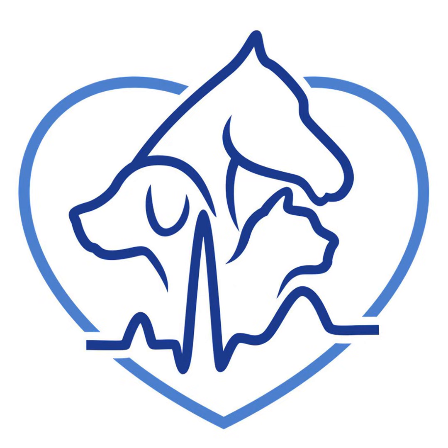So how wide is this area of cats that we should utilize it in? We don't quite know that answer, but we're using it right now. We used it yesterday in a cat who came in for a consultation, who we were measuring a wall thickness on two-dimensional images, both in the short and the long axis, of around 5.8 up to 6.3 millimeters. So this is right on the decision-making borderline. Do you have this? Do you not? And so we used contrast in that cat. It was a cat who already had a catheter in, so it was very convenient. I had some available, and so we utilized it.